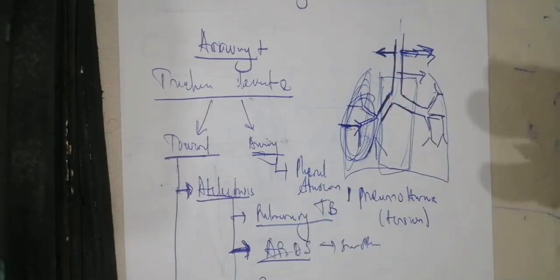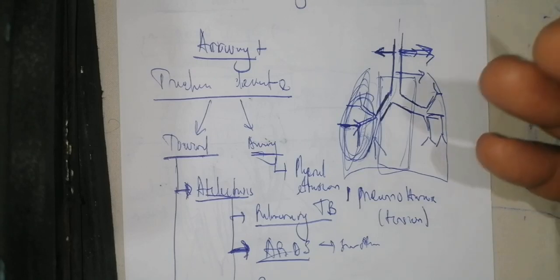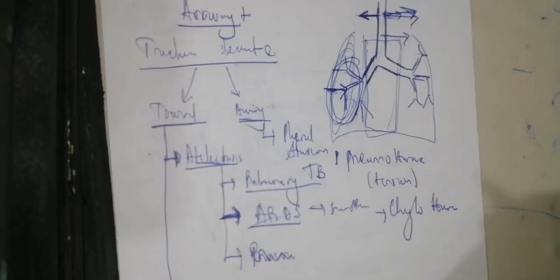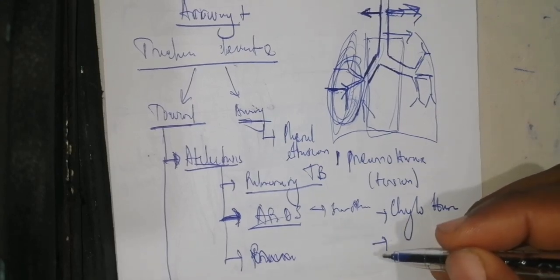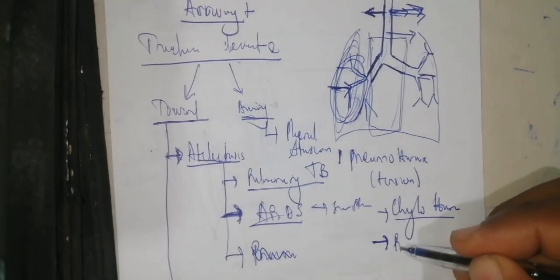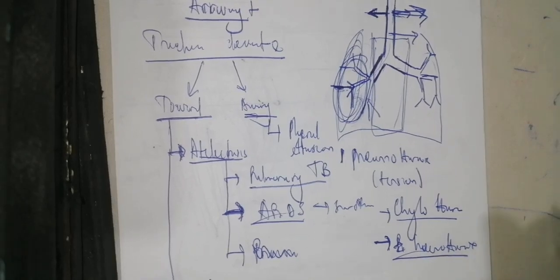Is it clear? So those are etiologies, or we have also other elements which can cause fluids at the level of the pleural space. We have a hemothorax, and we have chylothorax, where chyle is just fluid of the thoracic duct or the lymphatic circulation entering into the pleural space. Hemothorax is when there is blood, basically.